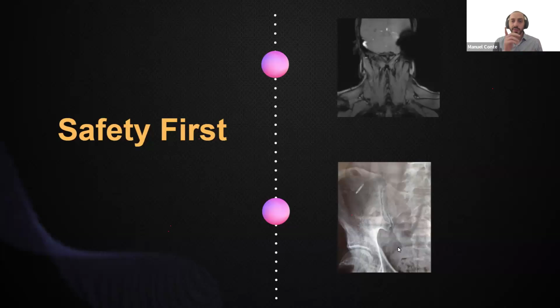And the upper one was an interesting case. It was a patient that came for an MRI of the cervical spine. He didn't have any operation. Actually, he had just an operation of the left wrist. We did the localizer, and we saw this huge metal artifact. So we tried to talk through the speaker to ask if he had any operation. He said no. So we went inside the scan room and took the patient out very slowly. We checked if the patient had hearing aids or piercings, and he didn't have anything.